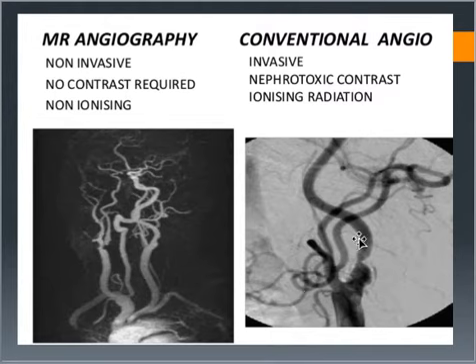You still get great quality images. And if you're strictly trying to diagnose, then MRA is a great option. But if there is any chance that you might want to do a therapeutic procedure, you would have to reschedule the patient and get them in at a different time.